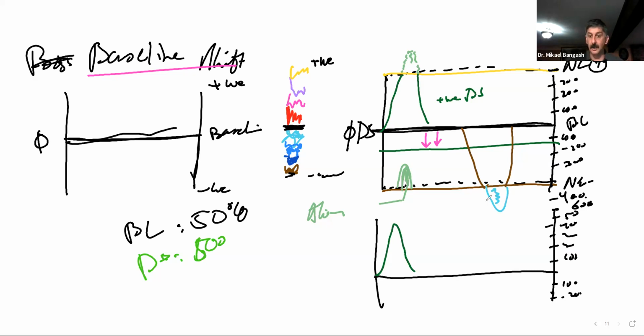We could still say our speed limit was 400 centimeters, where the velocity of blood was 500 centimeters per second. The only thing different here is that in the first case we brought the baseline down.